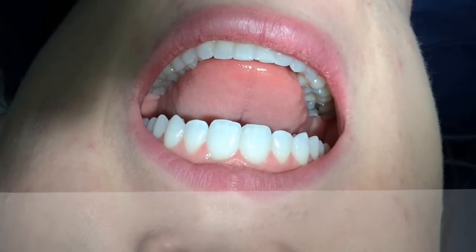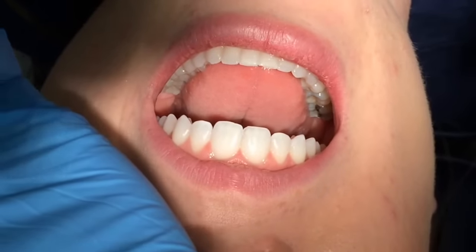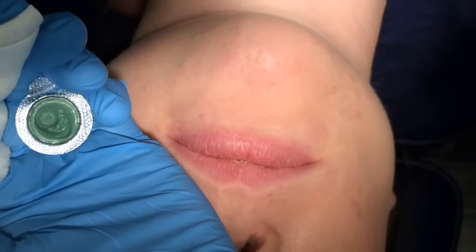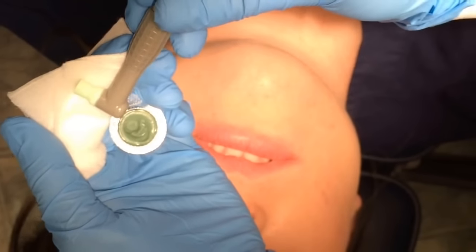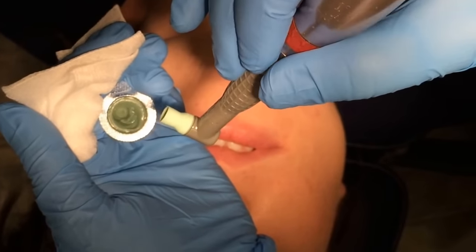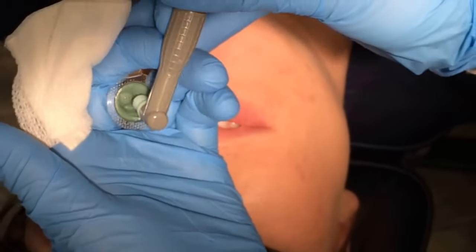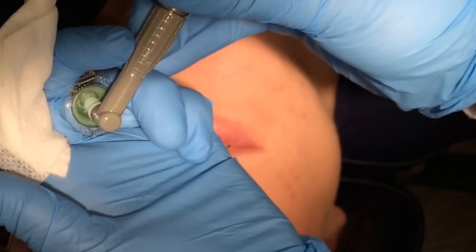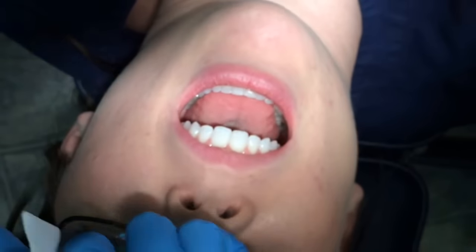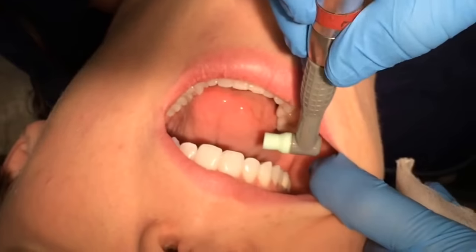Here's an example of how to hold prophy paste. I hold the prophy paste in my hand with some 2x2 gauze to wipe excess saliva. The prophy paste is between those two fingers. I hold like this so I can come in and grab, keeping these two fingers tucked so they're not in the way. I also take my thumb and pinch it so I can use this finger as retraction.